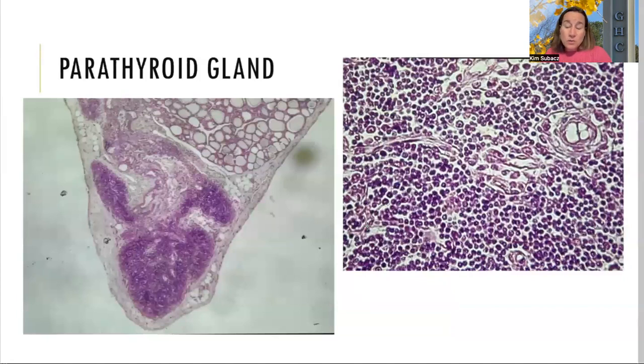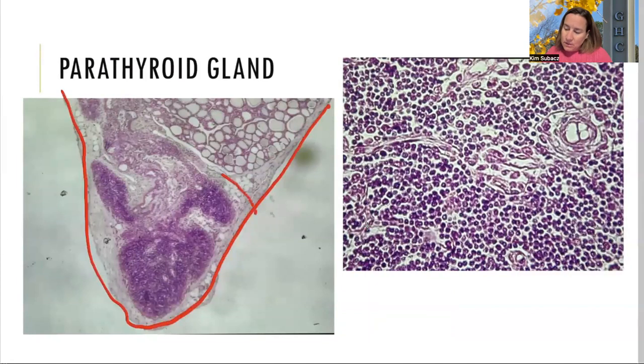Parathyroid is also related to calcium. So here again was that whole thyroid and parathyroid together on the slide. Now we're just going to look at the parathyroid part right here. And this was the parathyroid part. So if we zoom in on that, we get this over here. When we zoom in on the parathyroid, we can see that there are lots of dark purpley colored cells. All these purple cells here are parathyroid cells, or chief cells is another name for these guys.